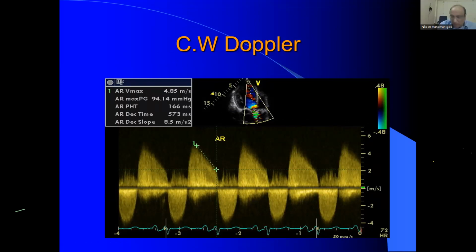Sir, once more, I'll just take it down. So today you are doing this, tomorrow you'll yourself say it is very easy. So the advantage is that if the blood flow direction is not what is expected, that gives an idea. Sir, away from the transducer is positive? No. Away from the transducer is negative. Yes, sir. Got it, sir. Thank you. The transducer is always pointing from above downwards.